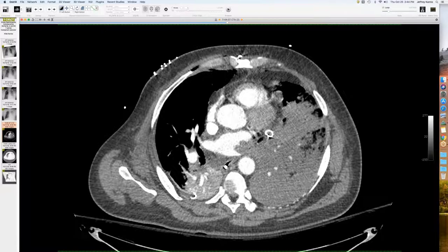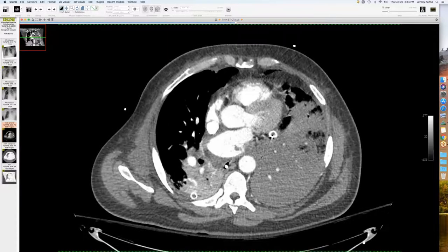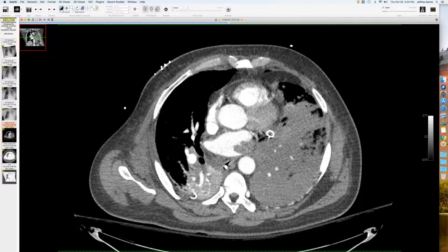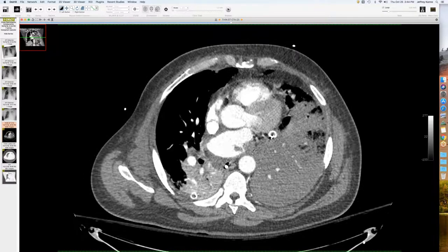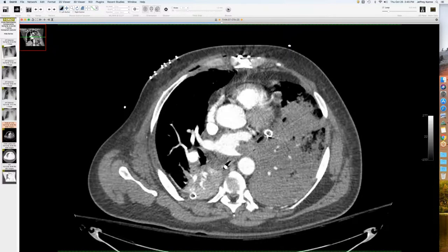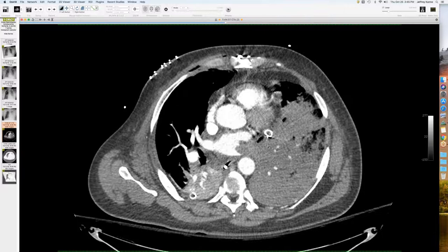They did a CT angio looking for PE and other possible complications. The left lung is not enhancing well — it's very boggy. But there's good arterial flow to it, there's the anastomosis, no kink. But coming down, there's a filling defect going into the left atrium, and the inferior and superior pulmonary veins are not filling with contrast at all. This boggy appearance and absence of venous perfusion, what looks like a big thrombus, was interpreted correctly as a venous thrombosis. They emergently took the patient to the OR — the lung was all swollen and looked like venous congestion, with a big thrombus. They had to do a pneumonectomy of the allograft for venous thrombosis.